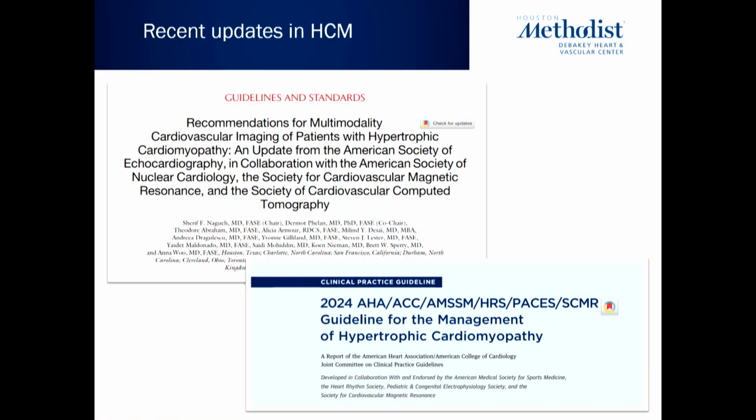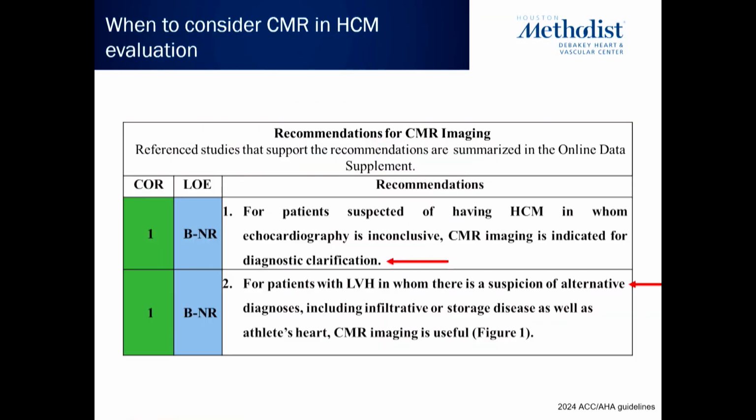So there's a lot of updates nowadays with imaging from the ASE guidelines with Dr. Nagueh, and then there's also a new 2024 guideline from the ACC and AHA. In terms of when to use CMR, some of the highlights is that when there's suspicion of having HCM and echo is inconclusive, you would want to perform CMR for clarification.